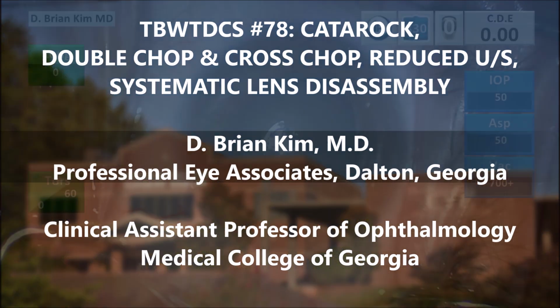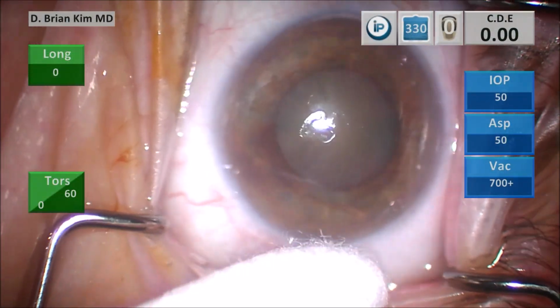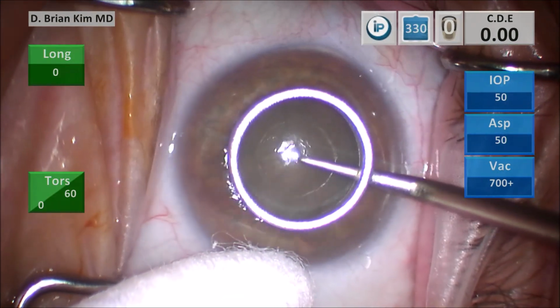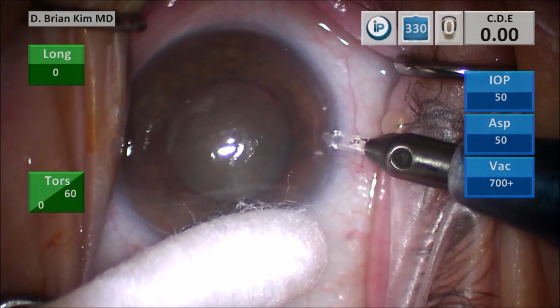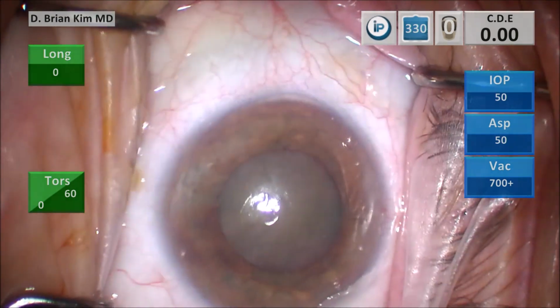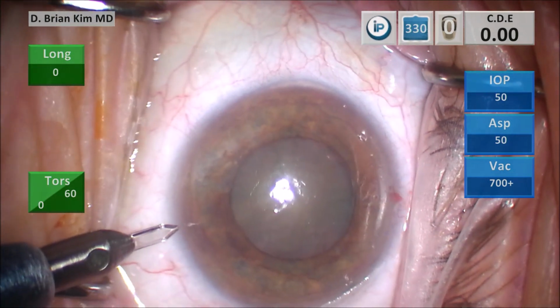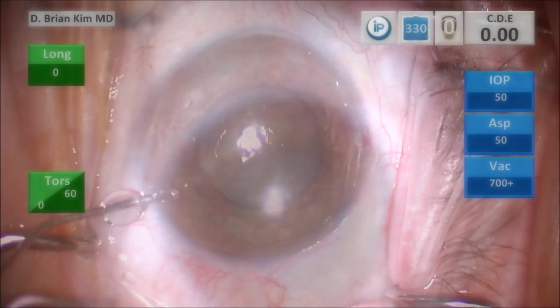So here's the dense lens. You can see not much of a red reflex, kind of a brown colored lens. Using a cotton tip to turn the eye so I can make my corneal mark. I'm using a diamond blade to make my paracentesis incision, first on the right side and then the left side. Make sure the incision is parallel to the iris plane, which creates a nice horizontal shelf, which will allow me to achieve a self-sealing incision.